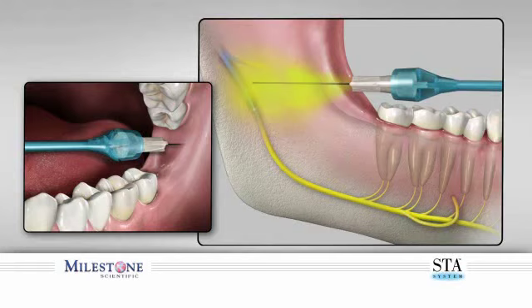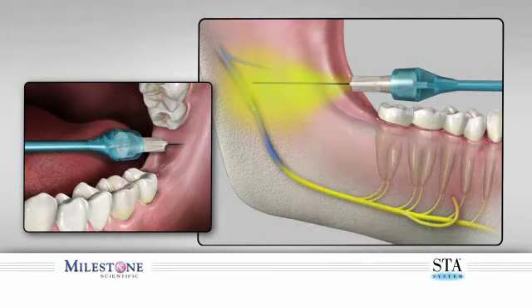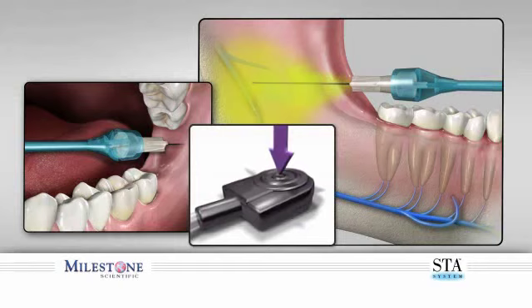Once at your target site, perform an aspiration by depressing and releasing the foot control. If the aspiration is negative, continue the injection. If aspiration is positive, reposition the needle and repeat aspiration by depressing and releasing the foot control pedal again until a negative aspiration is obtained. Continue the injection by depressing the foot control pedal. It is recommended that the first 1/4 of the cartridge be dispensed using the control flow rate before you transition to the second faster rapid flow rate.